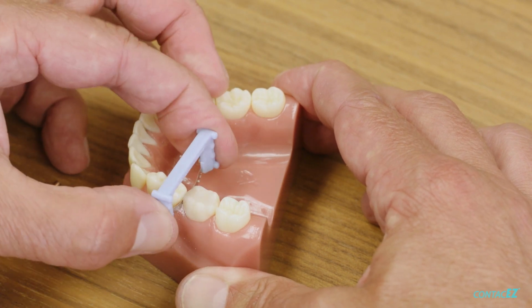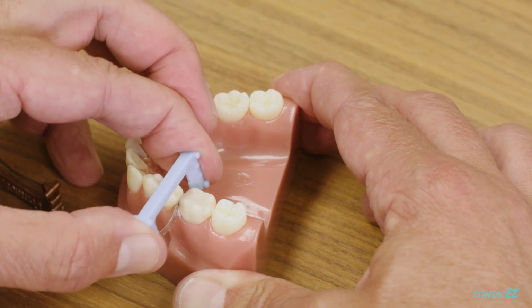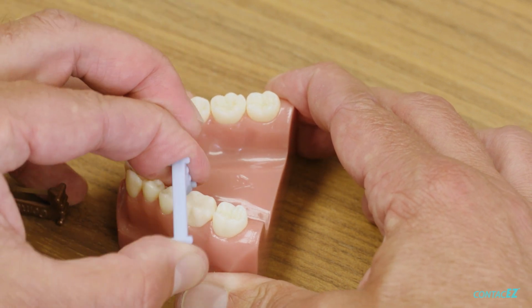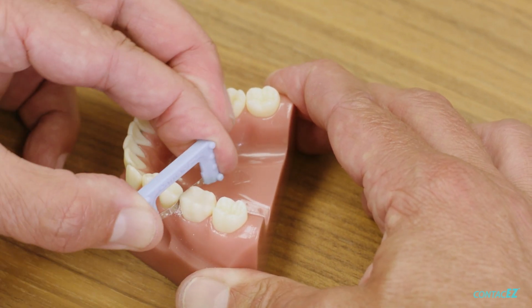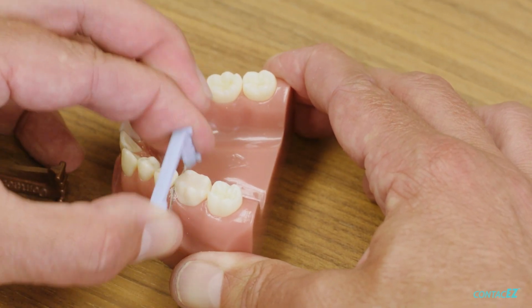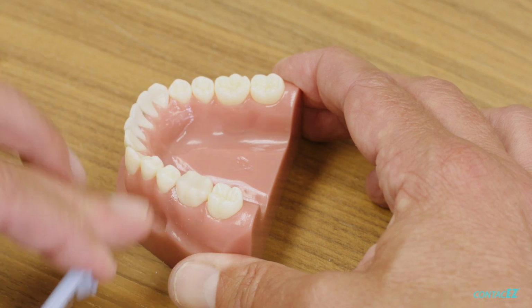If I just leave it straight in here and go back and forth, I can cut through it, but I can actually feel a portion over on the lingual, not so much on the buccal, that feels pretty good, but I can feel myself cutting through a little more on the lingual as we go back and forth. So it's a matter of going through there.